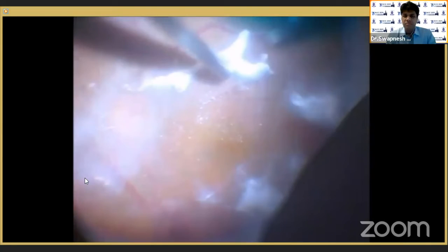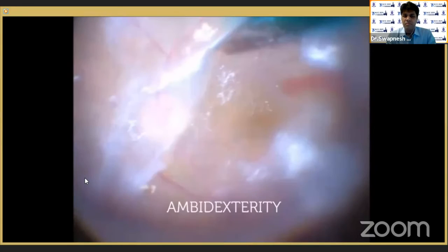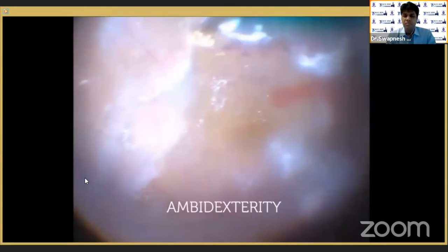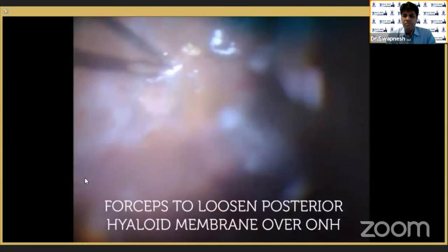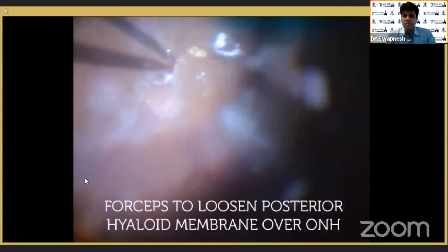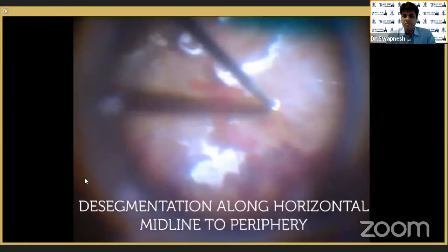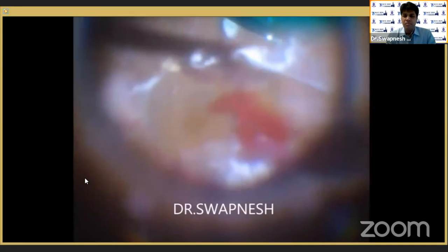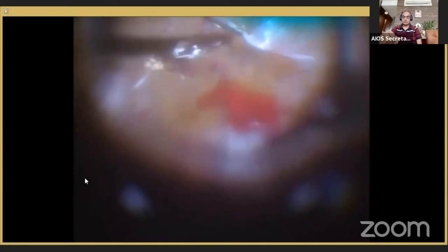There are multiple areas of fibrovascular proliferation with point attachments, and we have to rotate the mouth of the cutter, as well as sometimes use our left hand to proceed with the dissection. Now I am using forceps to loosen the posterior hyaloid over the optic nerve head. We have to be extremely careful while doing this procedure because we can induce a lot of bleeding.